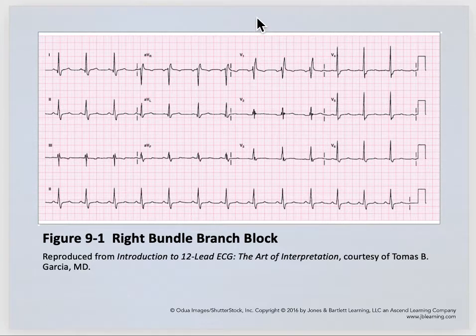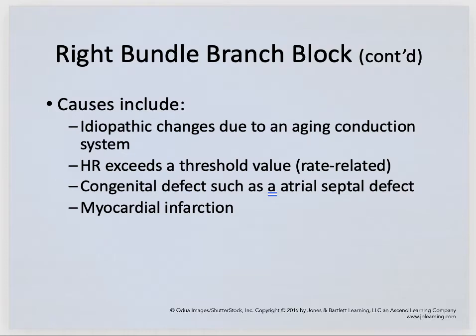Inverted, again, you could see inverted T waves. You could see a very deep S wave. But the big hiccup is always going to be our strange looking thing here in V1, right? That's what we call that R prime. We don't really know what the causes are.